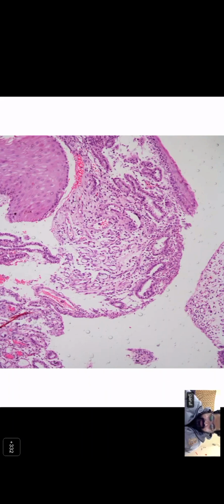Okay. So maybe Poonam or Himali can say, is the squamous epithelium okay at this point? We have a urethral tumor. Is there something normal here? What is the normal thing here? So urothelium. It's squamous. This is a squamous metaplasia of the urethral lining. Yes, sir. So yes, this is definitely squamous.